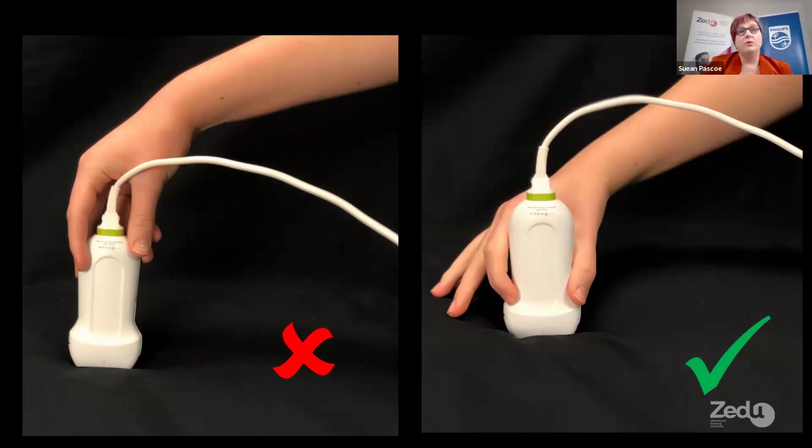If you're having trouble staying still for that Doppler, the more of your arm that you can rest on something, the more stable your hand position is going to be. So bring the bed up a little and just let the patient know you're going to rest your arm on their leg. Rest from your elbow through to your wrist on the patient so that you can have the maximum control of the probe and the best chance of keeping the probe still.